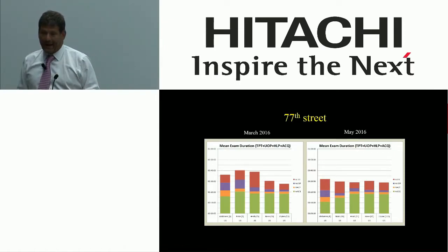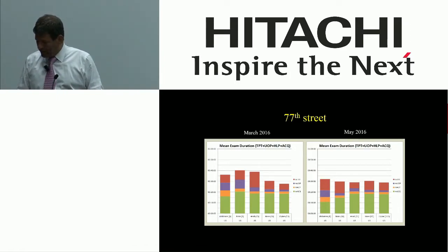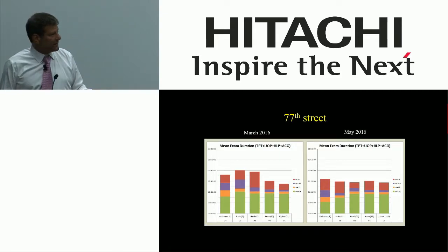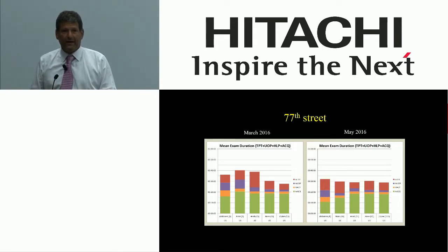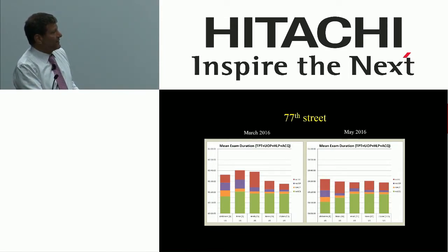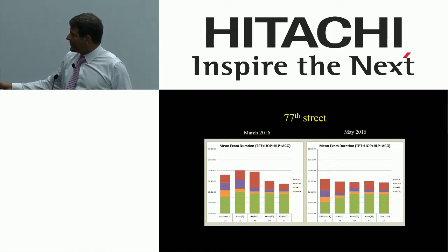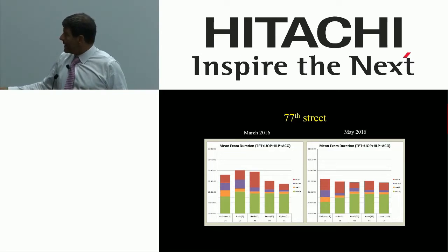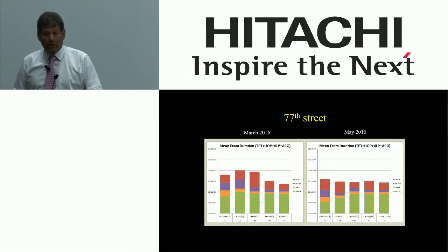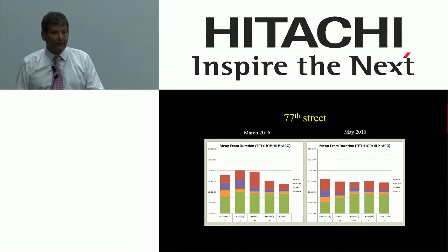Now, between March and May, in this particular single facility, we did a few things. We optimized some of the scan sequences, but we also became more value-driven and asked the radiologists to live with what they found was essential. So just for the sake of fairness, although this pointer is not strong enough to go that way, you'll see there's a 30-minute line here. You'll see the green in this particular slide is diagnostic scan time, okay? The blue and the yellow are things like localizers and preparation time. And the brown is patient handling time, on and off the table.